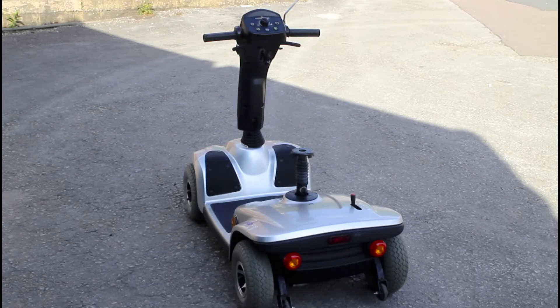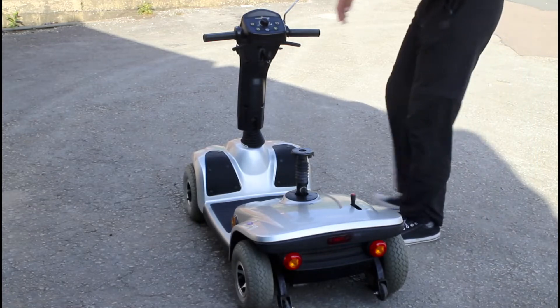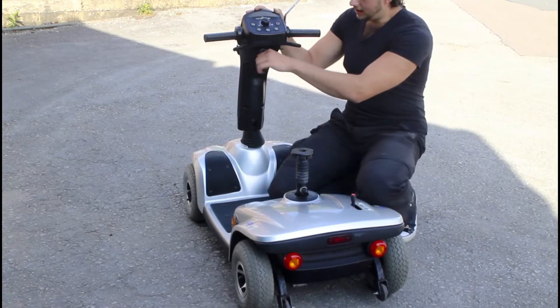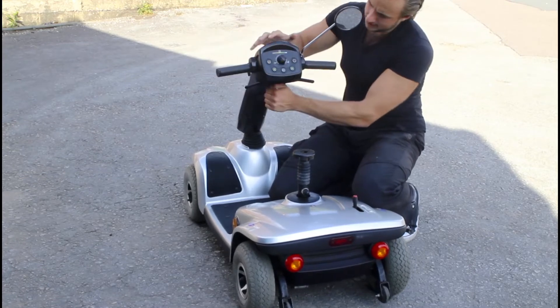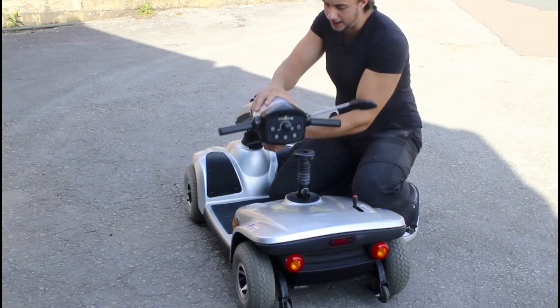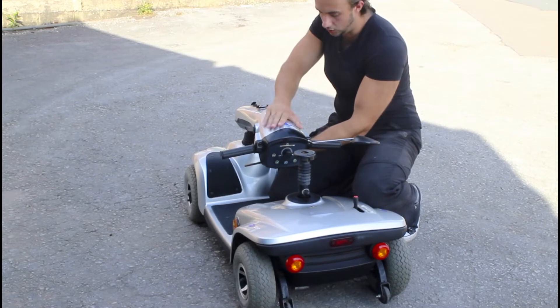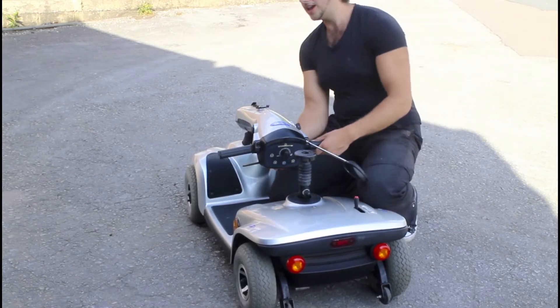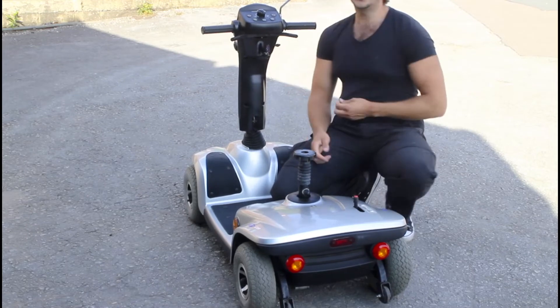It's all different on different models, so I want to show you the differences. On this particular model, the Invacare Leo, it's just this simple lever. If we push this down, the handlebars automatically come down. You want to fold those just to where it's limited, fold the mirror down, and you're good to go — and same coming back up.